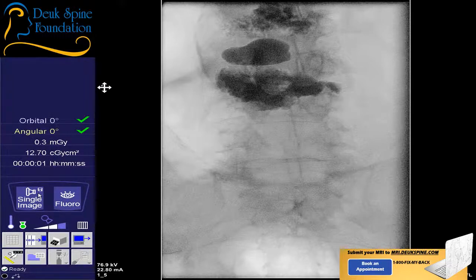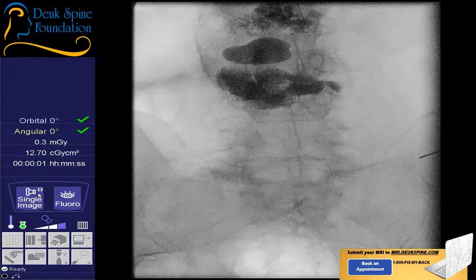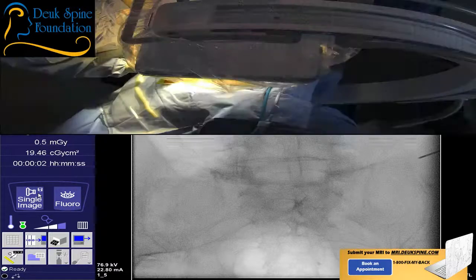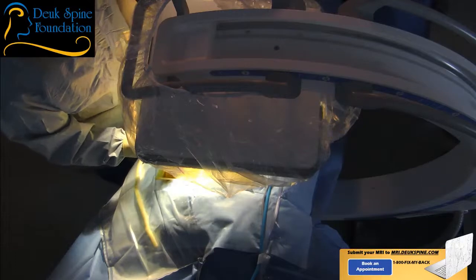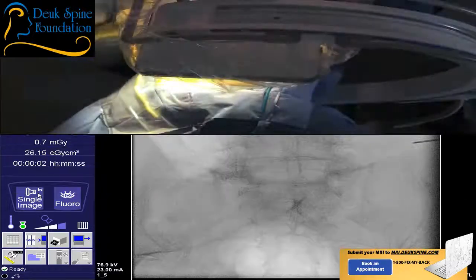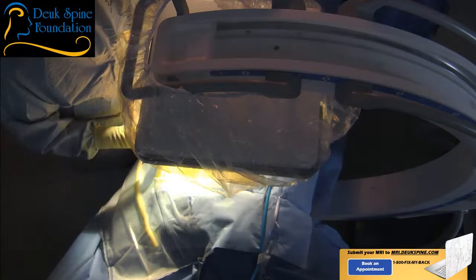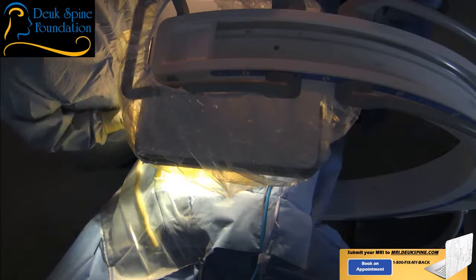So we can see that he's had kyphoplasties before for problems with his spine. He's had fractures. That's better. And I didn't do the kyphoplasty. Somebody else did. Shot? Yep. Need to start a little bit higher. Yep. Are you feeling any of that? Is that better? How are you doing?